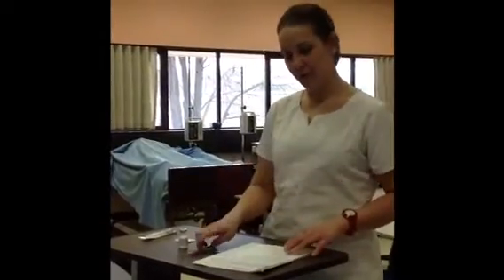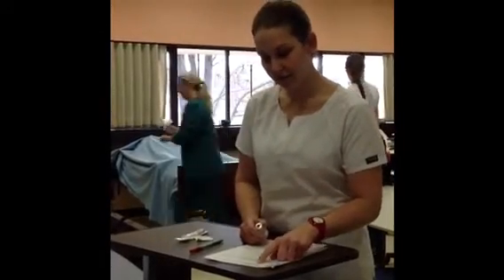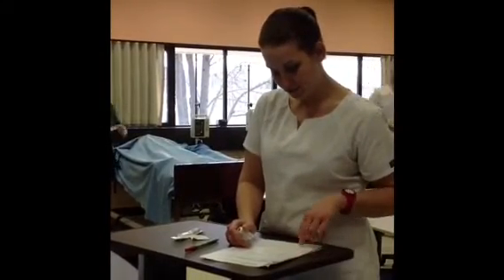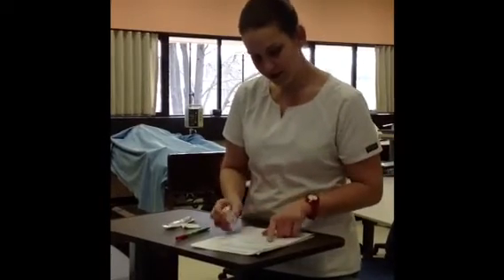Okay, I'm at my workstation. I'm going to prepare the vaccination that I'm going to administer. So I already gathered my supplies and the medication, and I'm going to check it again. Right patient, Allison Alvarez. Right med, it's the hepatitis B vaccine. Right route is intramuscular. The right time, it's now. It's an open order from the doctor, so I have that. The reason is vaccination. I have signed consent from the parents, and everything matches again. I checked it, so I'm going to go ahead and draw this up.